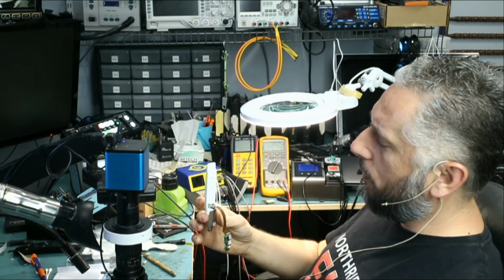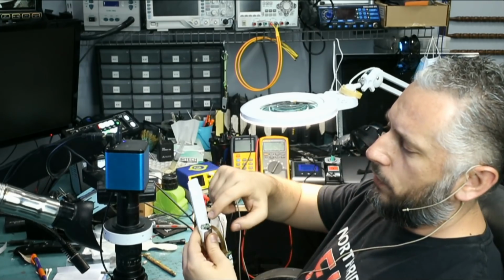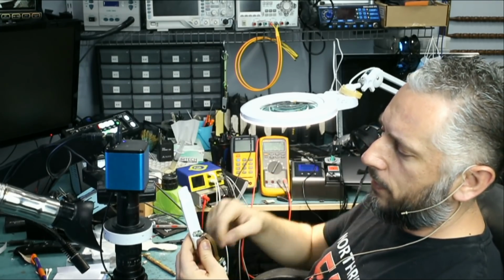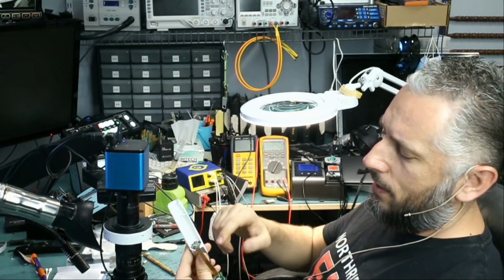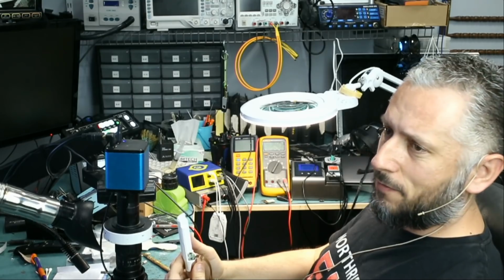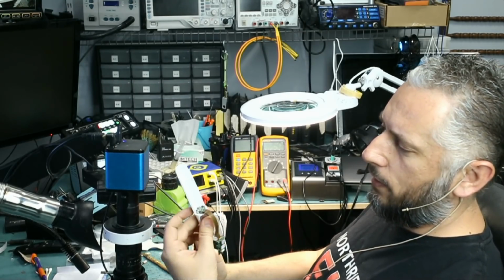Now it's a little bit awkward working on this board because we have to keep it in a vertical position like this, and we have to precisely solder the pins back on the board. I tried to take the board out, and it seems like it's involved because there are connections done from the bottom. So we're gonna keep it the way it is.